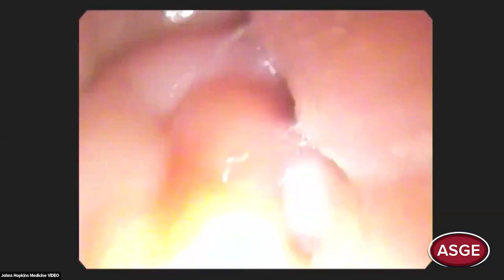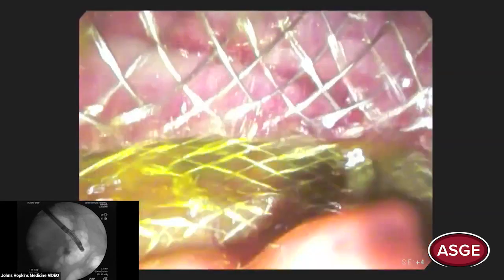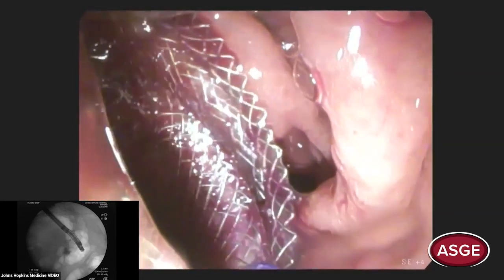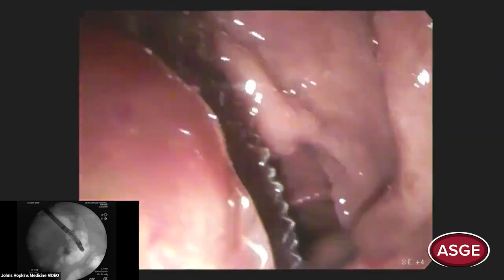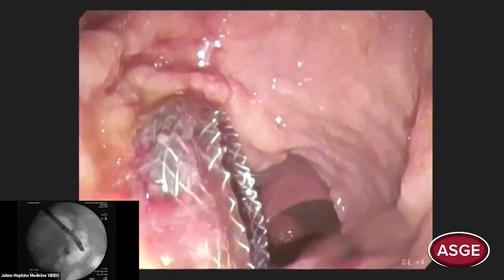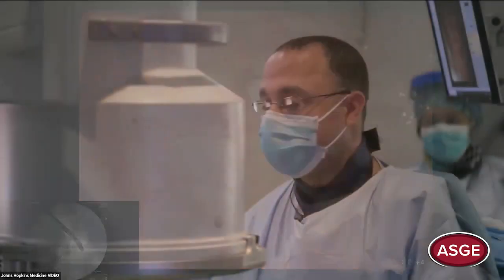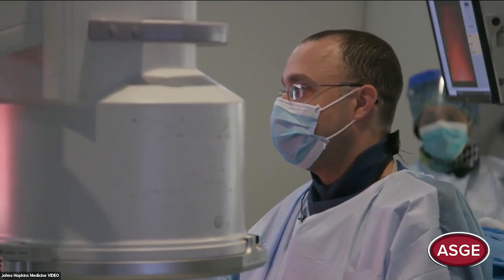Now we're pulling the scope back to the stomach — to the proximal stomach — to show how to pull the scope back. While pulling the scope back, I'm unlocking my wheels, making sure the scope is straight so we don't hook on the stent. Last point: when pulling back, check to make sure the stent is still on the luminal side. The plan is to bring him back in four weeks for EHL, pull the AXIOS at the same time. The stent in there may also start to break down the stone a little bit over the next four weeks.